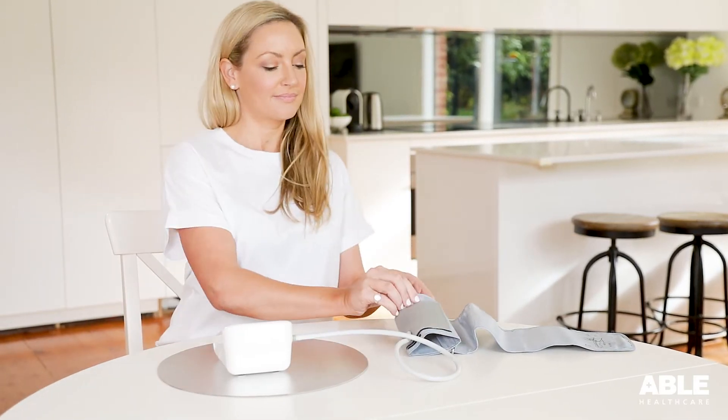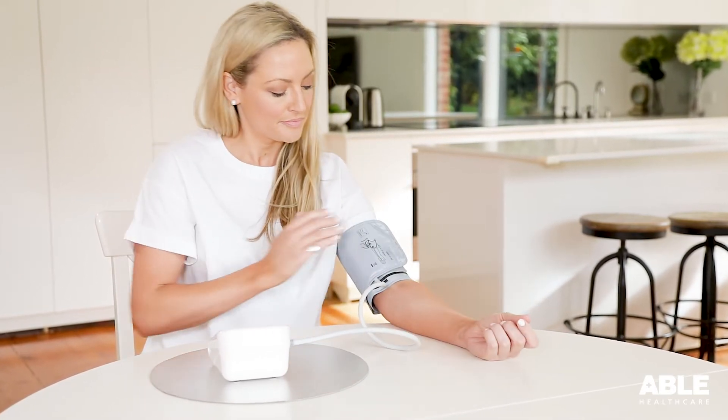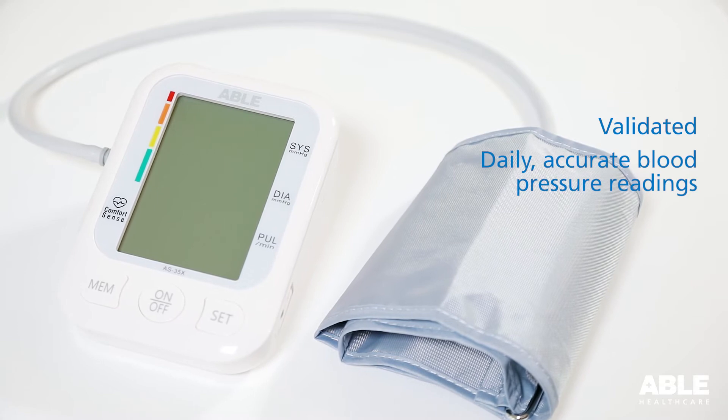Regular checks of your blood pressure based on your doctor's recommendation can help to keep your blood pressure under control. The ABLE blood pressure monitor has been validated for daily accurate blood pressure readings.